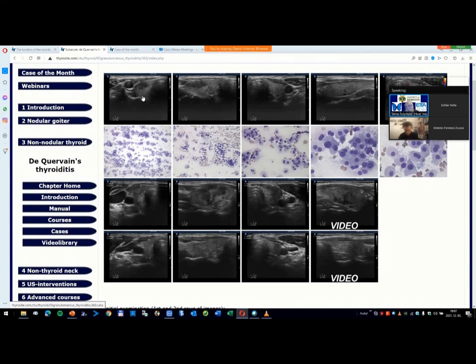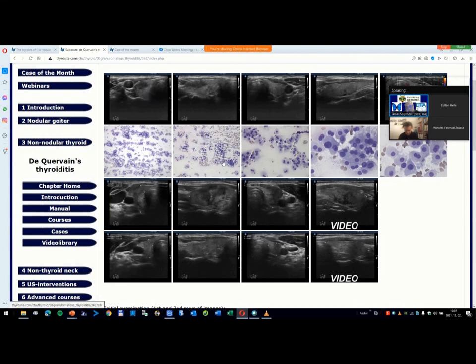Your question was whether this was a unilateral disease. At the first appearance, the thyroiditis affected only the right lobe. Four weeks later, the left lobe also became affected. This rapid change is very specific of subacute thyroiditis. Hashimoto's thyroiditis cannot change over weeks — it is a quite stable disease. It can also change in postpartum thyroiditis, but in no other condition is it imaginable that within weeks or months such great change could be observed as in this subacute case.